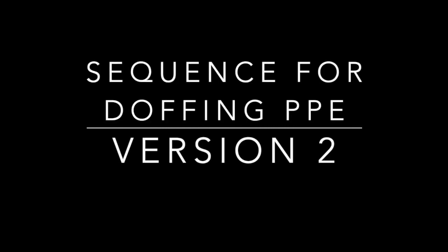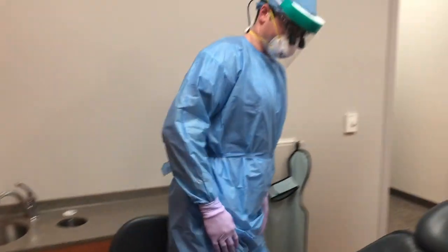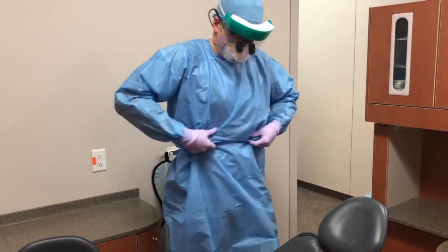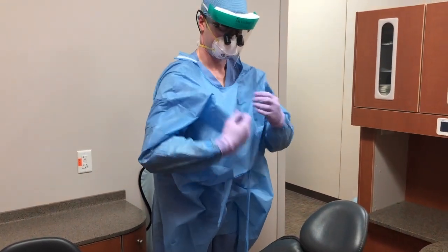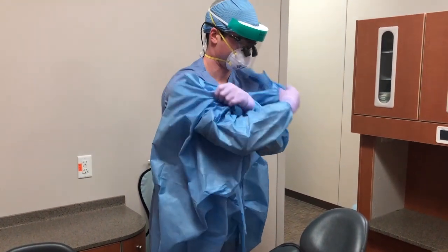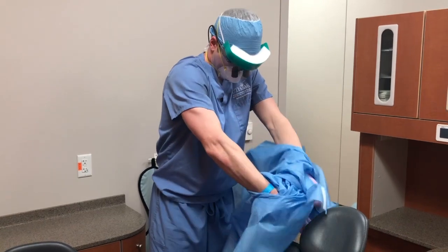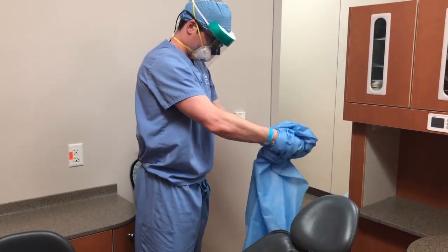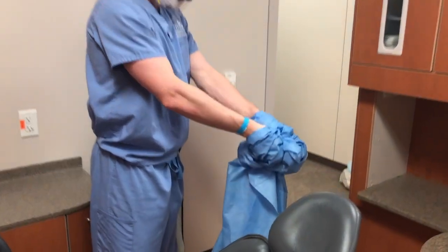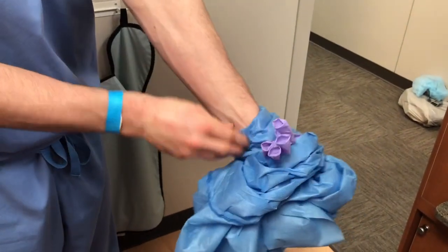We'll now cover the second acceptable method for doffing PPE. In this method, you will remove the gown and gloves in one motion — pulling the gown away from the body, grasping at the shoulders, and as it comes off you're turning it inside out, rolling it off the wrists and removing the gloves along with the gown.